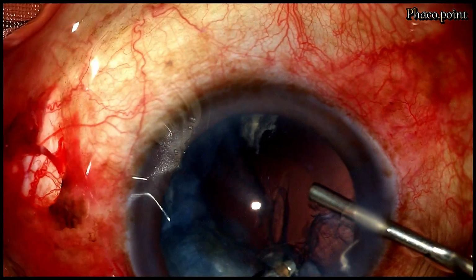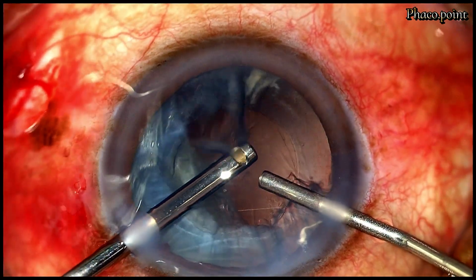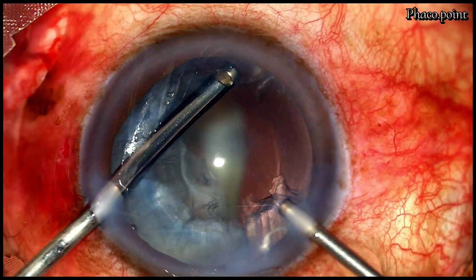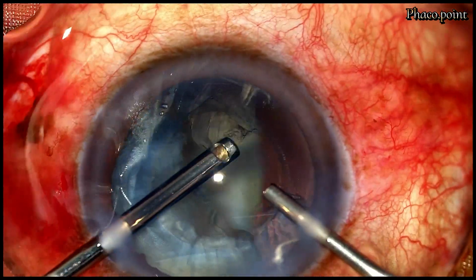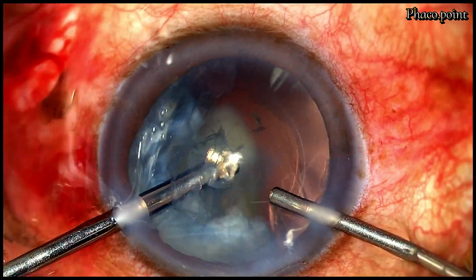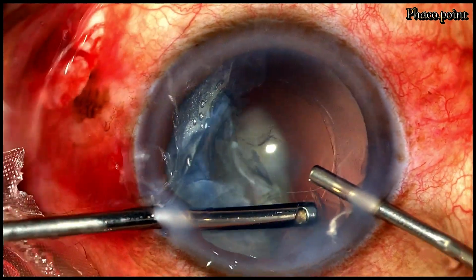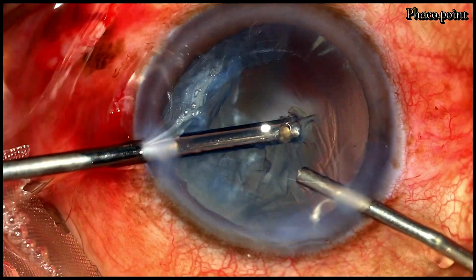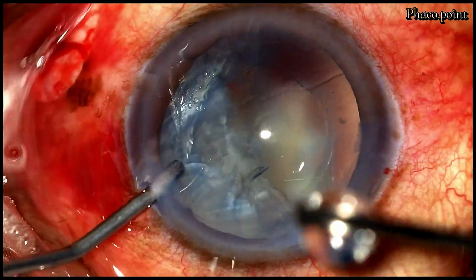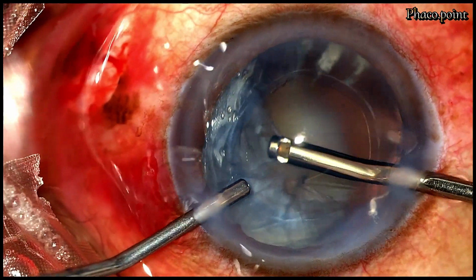Let's now watch the rest of the cortex wash using the IA cut mode of the vitrectomy. Notice how as the cortex is being drawn out, you can see the fragment in the posterior segment floating up slightly anteriorly. Now, having completed the removal of the cortex on the right side, the instruments are swapped over and the rest of the cortex is similarly removed.